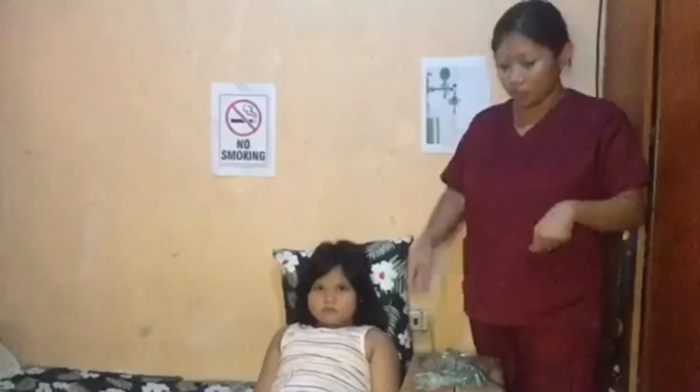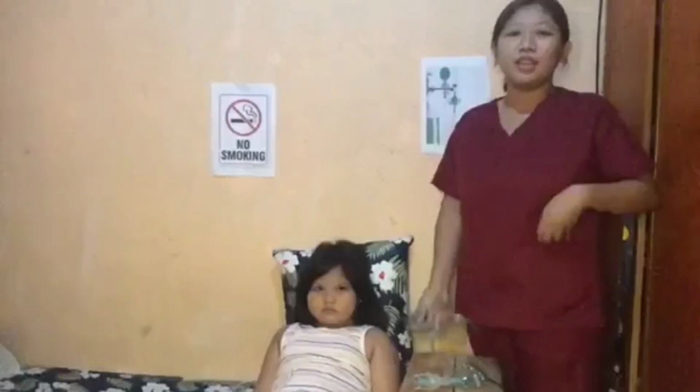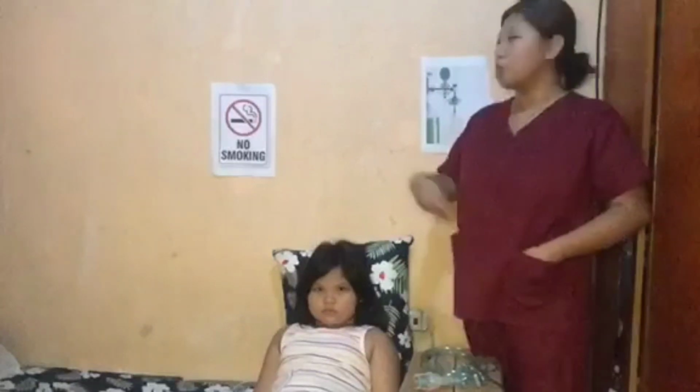The equipment that we need to perform oxygen administration are oxygen devices, to check the oxygen delivery ordered by the healthcare provider. We also have the oxygen tubing, which is considered as the extension tubing, humidifiers if indicated, sterile water for the humidifier, oxygen source, oxygen flow meter, and appropriate room sign.